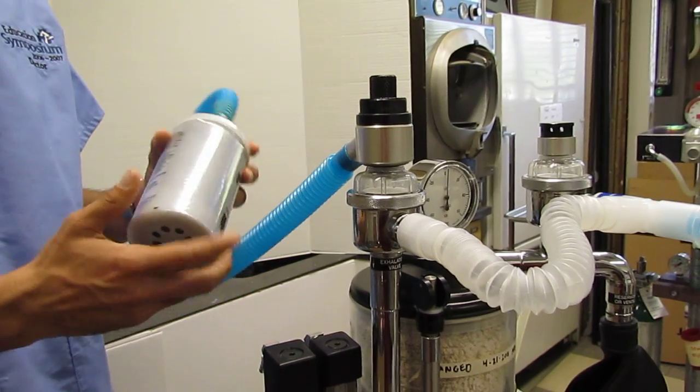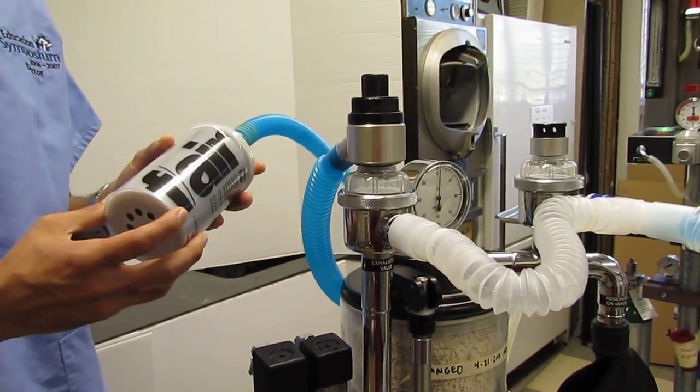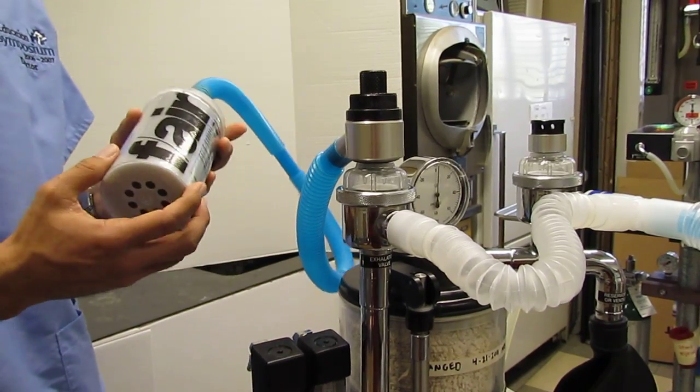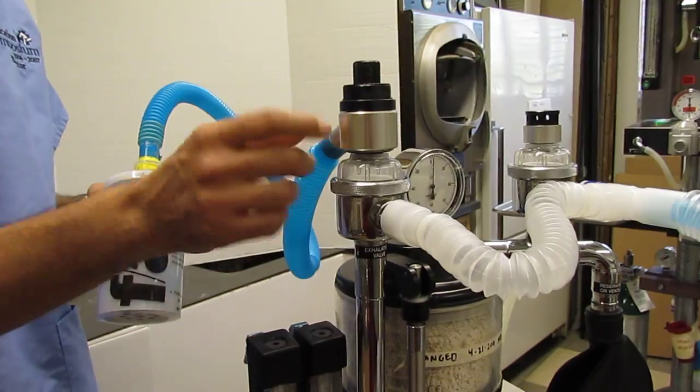This fair canister will gain 50 grams of weight when it has been used up. In other words, the activated charcoal will have absorbed about 50 grams of anesthetic gas. Okay, that's any excess anesthetic gas that leaves the system.